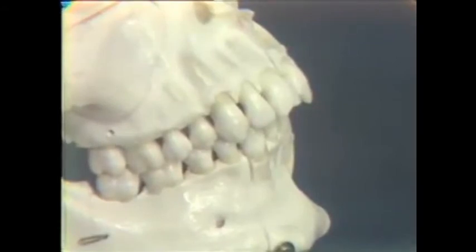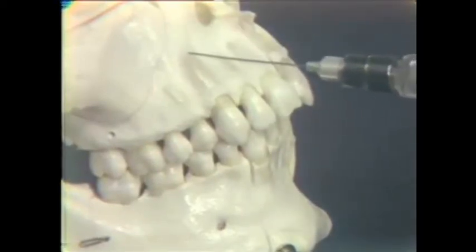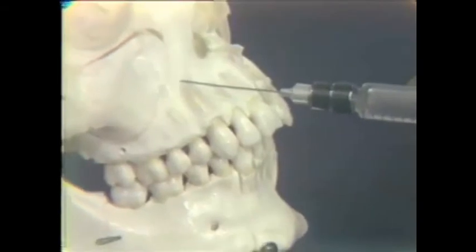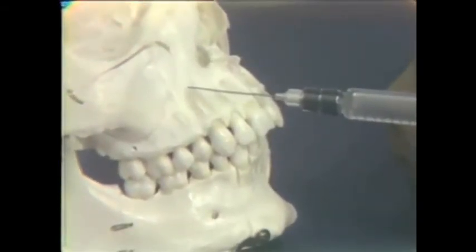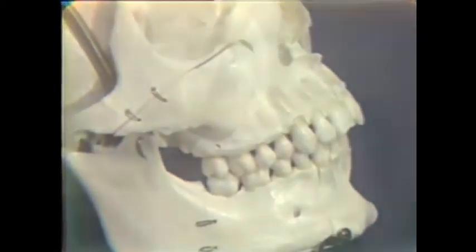Labial infiltration, mouth half closed, lip grasped and retracted laterally so the vestibular tissues are again tense and taut. Needle directed superiorly through the vestibular tissues and quickly carried to bone. Aspiration and injection of 1.5 cc's of solution will anesthetize the maxillary cuspid very nicely. Now let's show it on the patient.